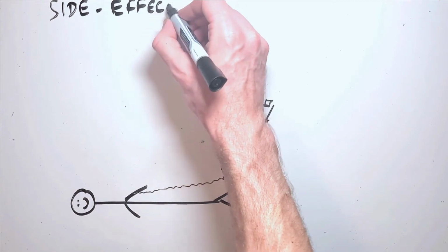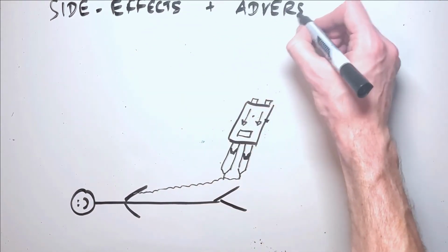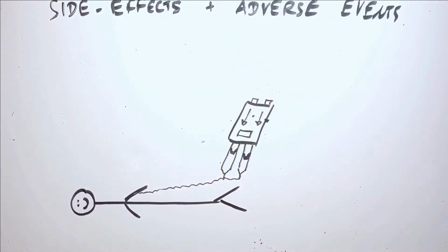Before, during, and after the contrast injection, both the technologist and the patient must be aware of normal side effects of contrast media administration, as well as the signs and symptoms of an allergic reaction to contrast media. Normal side effects can include a warm flush feeling, a warm sensation in the bladder that feels like they're urinating, or a metallic or garlicky taste in the throat.